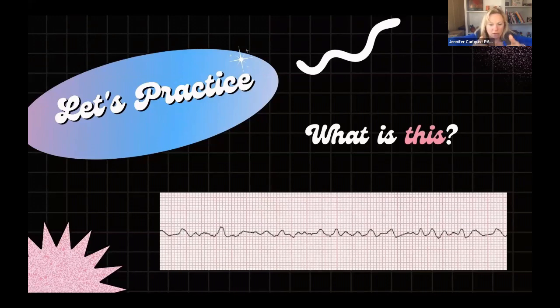So I look at the strip and it looked to be like VTach. It was labeled as VTach, the machine labeled it as VTach, and it was pulled out by the nurse as VTach. He says, I got summoned to the heart center for this strip. What would you do? I love that game. And I was like, well, I would. He goes, stop. If the first thing out of your mouth isn't go check the patient, then don't even talk to me. I was like, oh, I love this game.